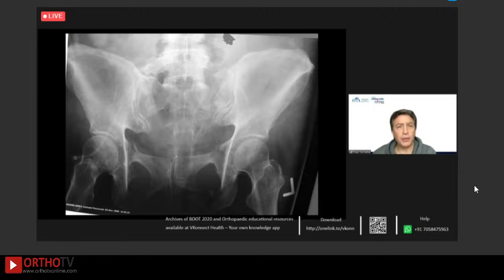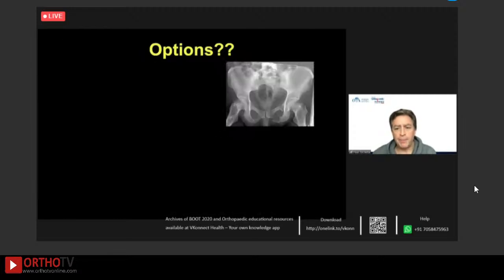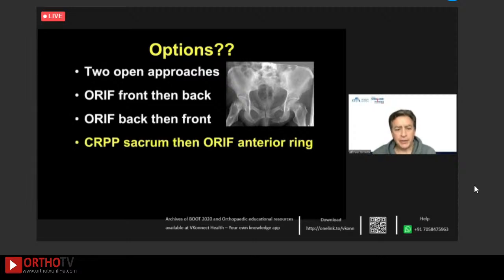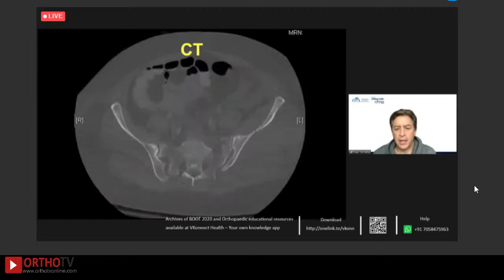So we treat these early with traction. So they went immediately into traction, was in the ICU in traction. And at that point, I said, what are the options? So you could do two open approaches. You could ORIF the front, then the back. You could do the back, then the front. You could do percutaneous fixation of the sacrum if you can get good alignment, and then do something to the ring or put a frame on the ring or just do fixation in the back alone.